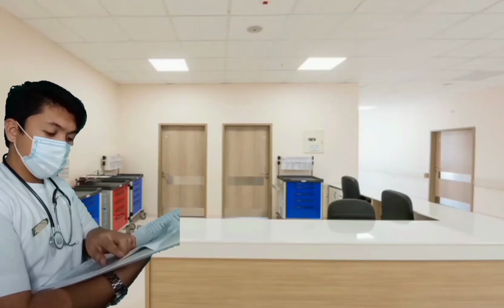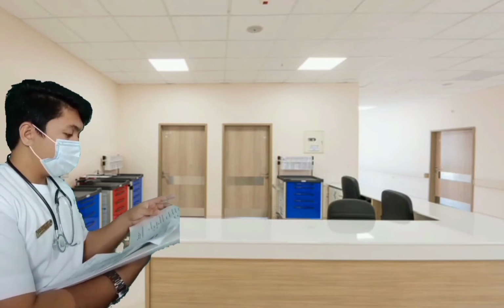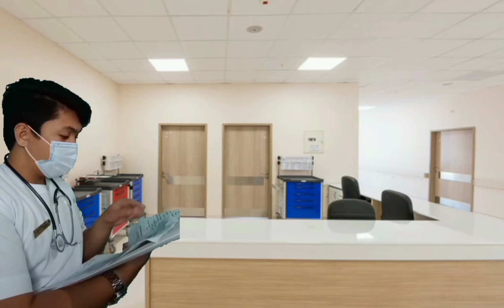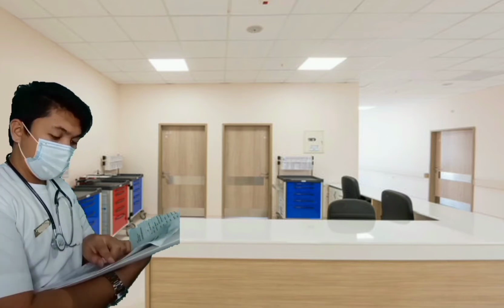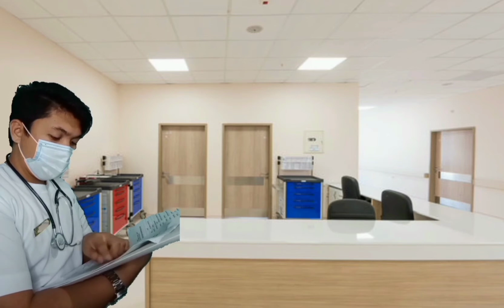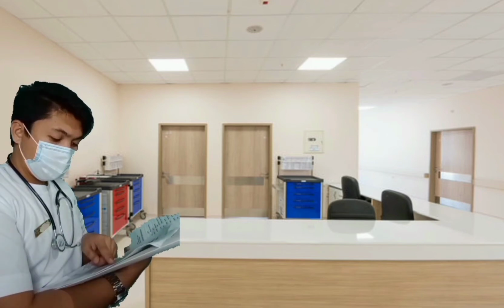Step 1. Gather equipment. Check medication order against the original physician orders according to agency policy. Clarify any inconsistencies. Check the patient's chart for allergies. This comparison helps to identify errors that may have occurred when orders were transcribed.